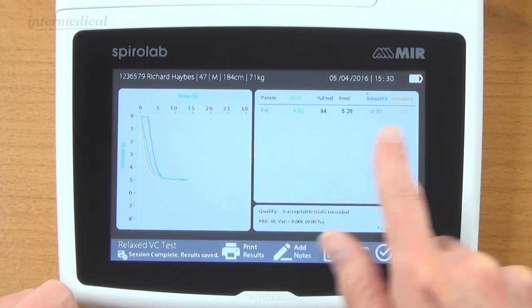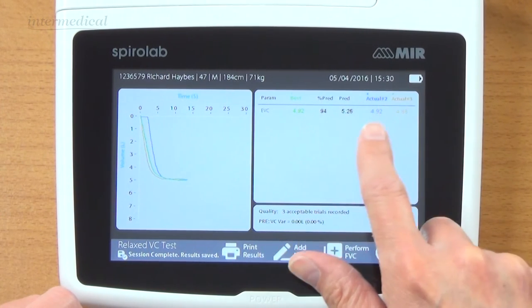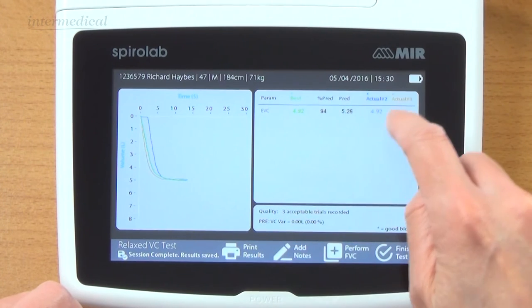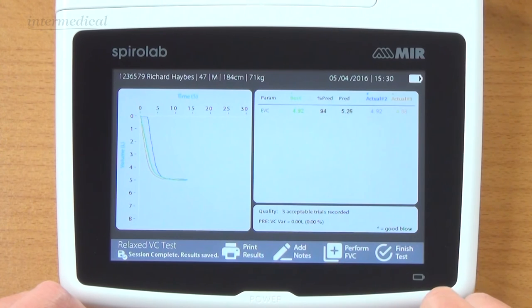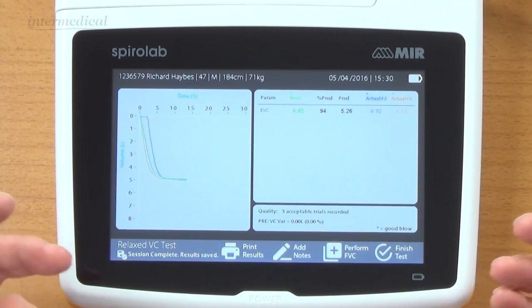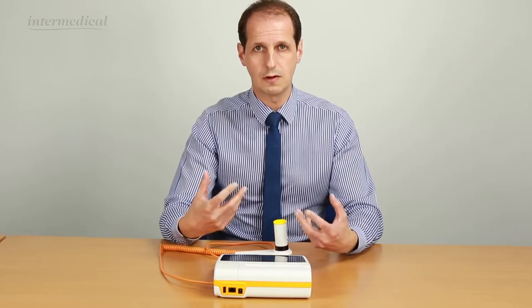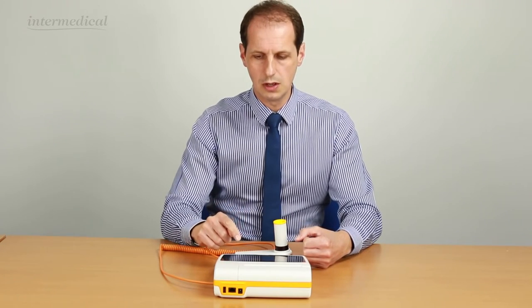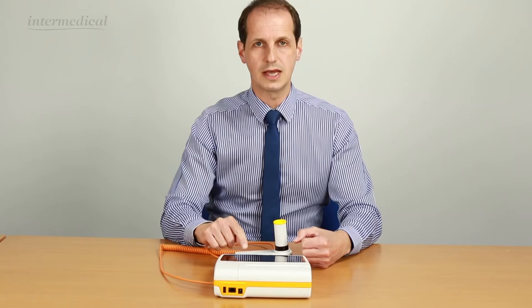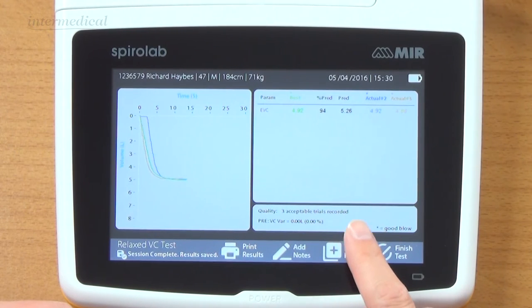Here are my three graphs and results. My three tests - my best one, actual two, and actual three. It says there were three acceptable trials recorded with zero variation between them. You can add some notes if you wanted to - if the person had been coughing, laughing, out of breath, not feeling well. You could print that off. But I want to perform a forced vital capacity test now.